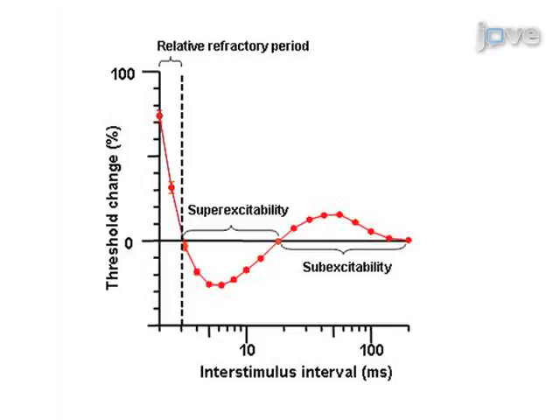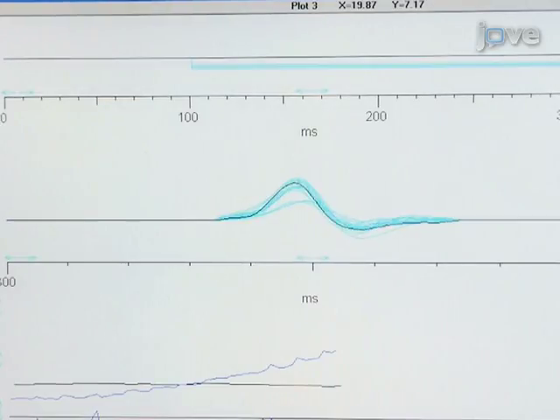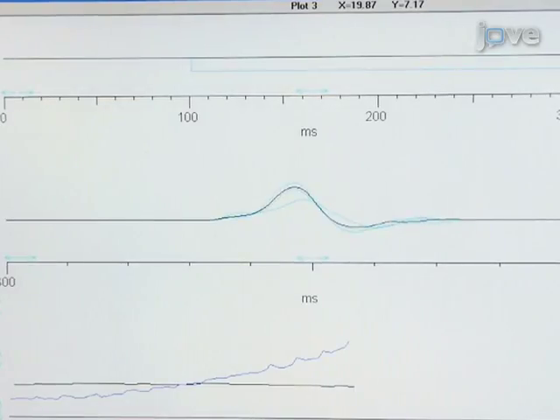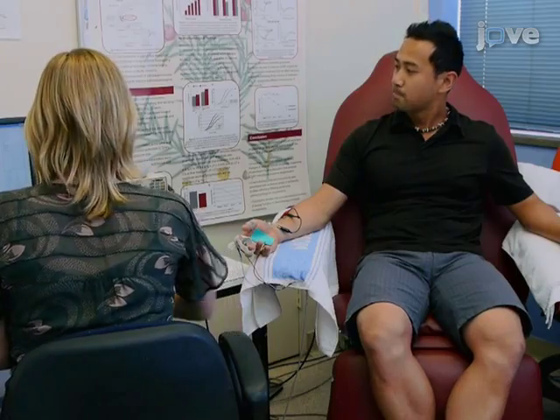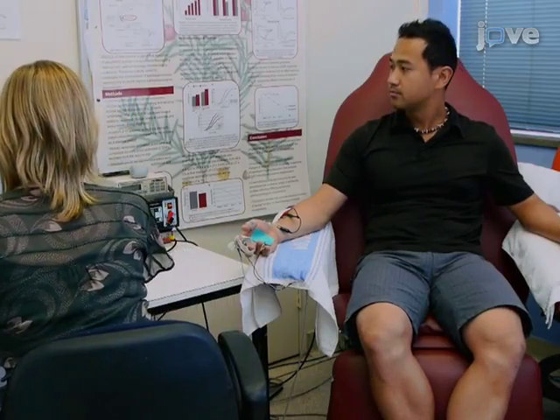Following the supra-maximal stimulus, it is more difficult to generate a subsequent response — termed refractoriness — reflecting the inactivation of voltage-gated sodium channels. Then, following the refractory period, a period of facilitation known as supra-excitability occurs. Finally, assess the current threshold relationship using polarizing currents of 200 ms varying in strength from plus 50% to minus 100% of threshold.